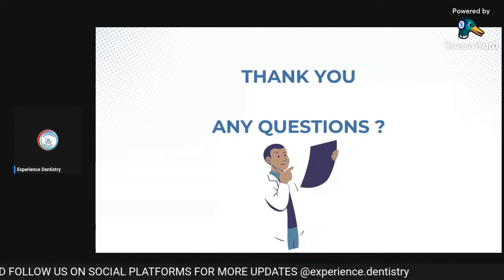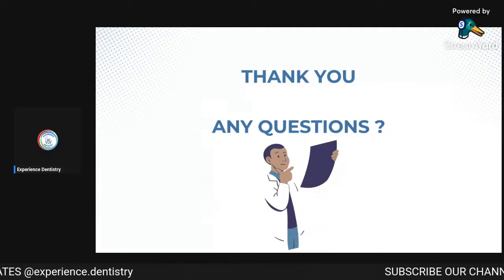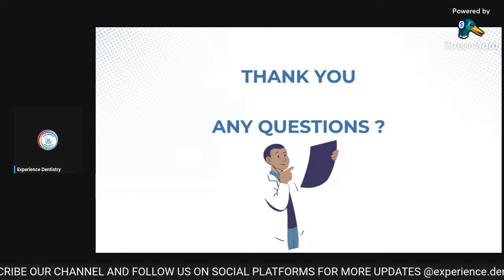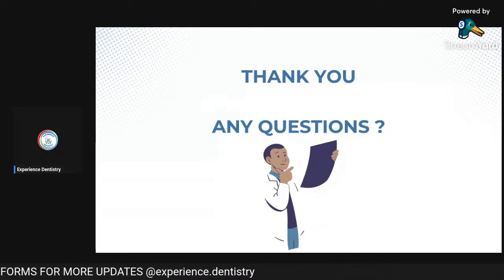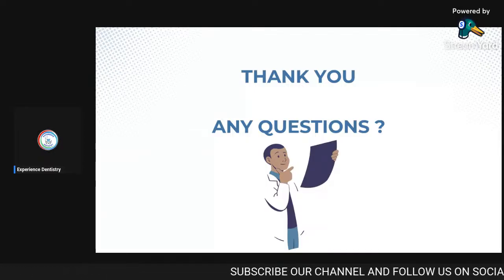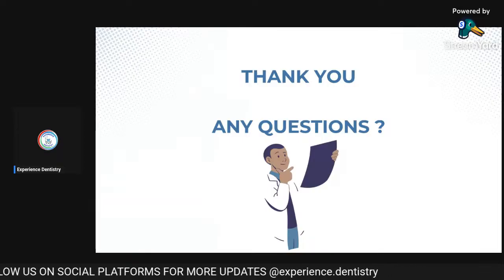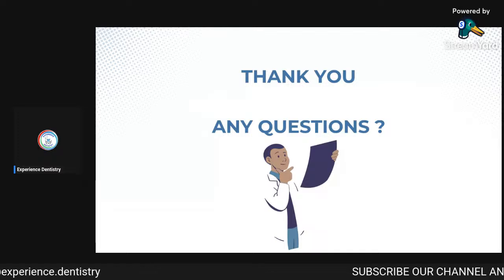To be honest, to be on the safe side, I would highly recommend don't do it. You can do it in the second trimester, basically, but the best thing, if you are going towards it, is to make sure that the pregnant woman is wearing a lead apron and a thyroid collar as well, because basically dental X-rays are teratogenic, they affect the fetus. So you need to avoid them as much as you can. But digital X-rays are relatively less harmful, so you can go towards them, but try as much as you can to avoid them. If there is a very real need, then you can go towards it.